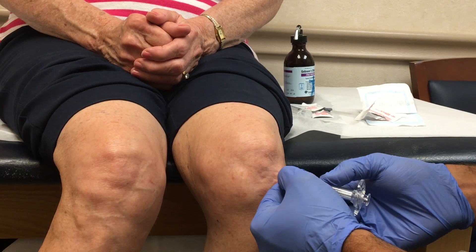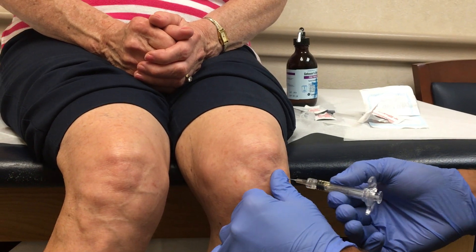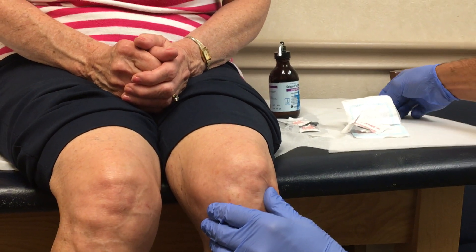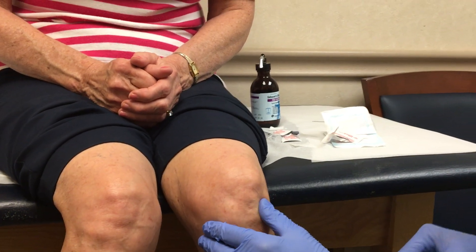And as you can see, I uncap the lidocaine and recap it with the visco-supplement, and inject the visco-supplement slowly. So that's how I administer a visco-supplement knee injection. Thank you.